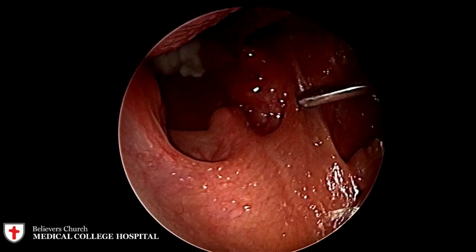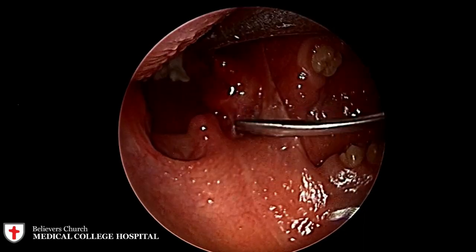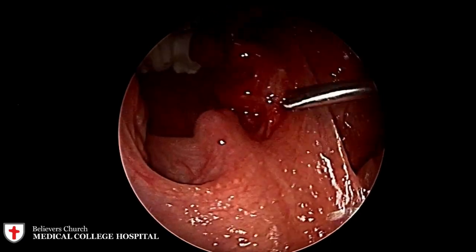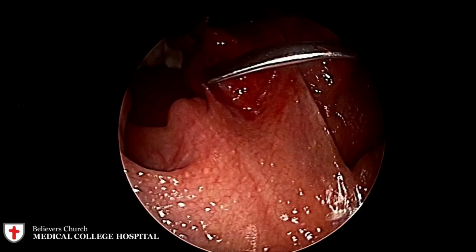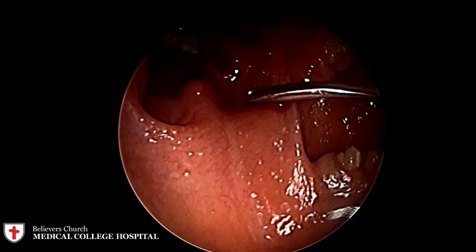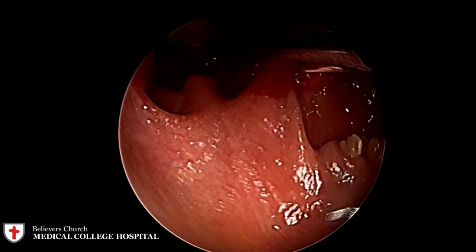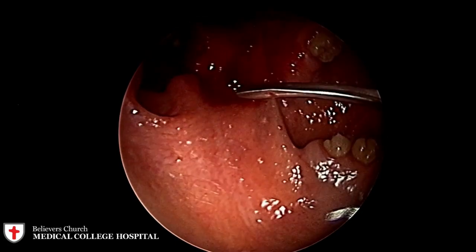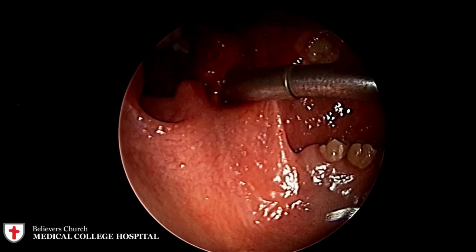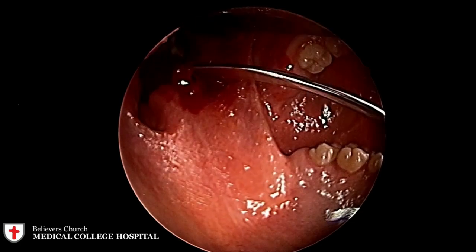The tonsil is being held by the Dennis Brown tonsil holding forceps. The incision is being made on the anterior pillar. This method of tonsillectomy is called the cold steel method; other methods include cautery, laser, and coblation. The dissection is carried out between the tonsil capsule and the superior constrictor muscle, using the Mollison tonsillar dissector with pillar retractor to dissect the fibrous bands.